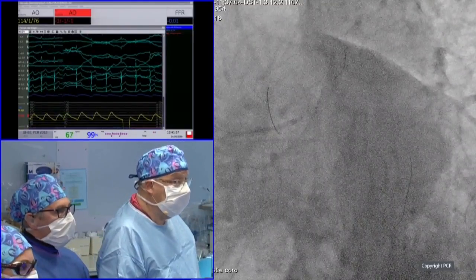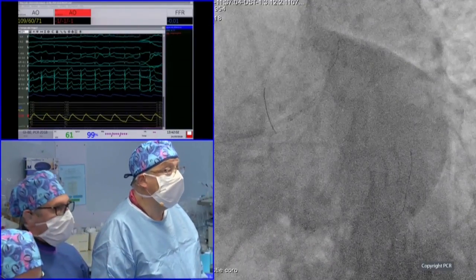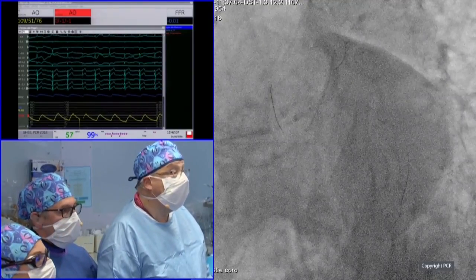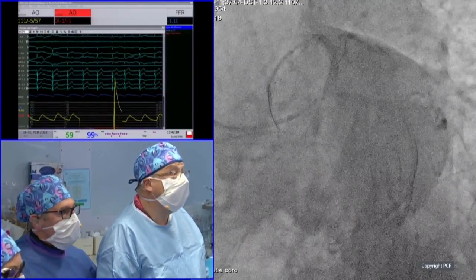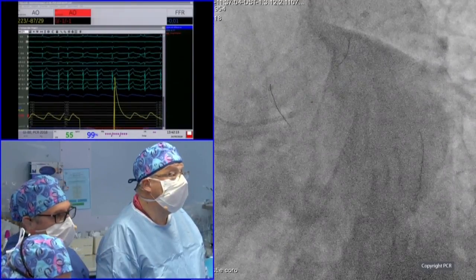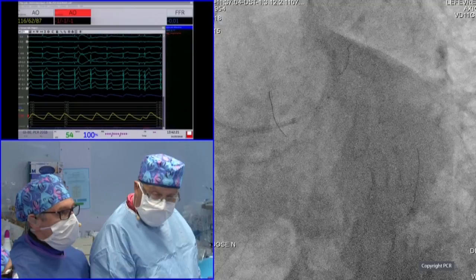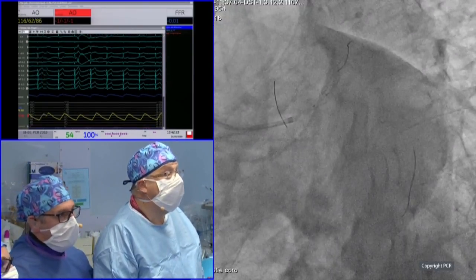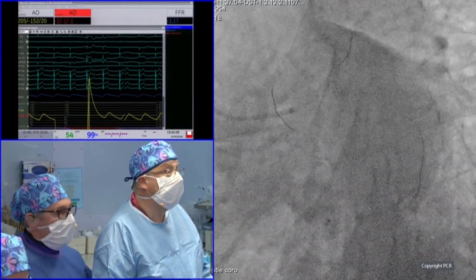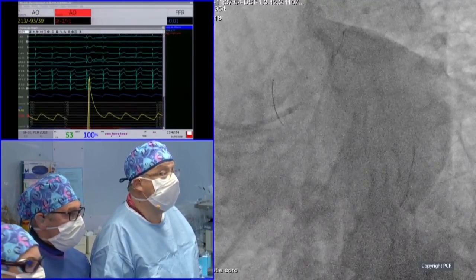There is an interesting question, Thierry, coming from the floor. How to select POT balloon size, by lumen dimension or vessel dimension in OCT? What's the opinion of the team there? So I think you can push, yeah. When there is disease, we make a calculation between LAD and circ, so 2/3 of the sum of both branches, and it's the best way. When there is no disease, I think OCT is perfect, lumen to lumen, so it's okay, Bernard? You want to test again, please?